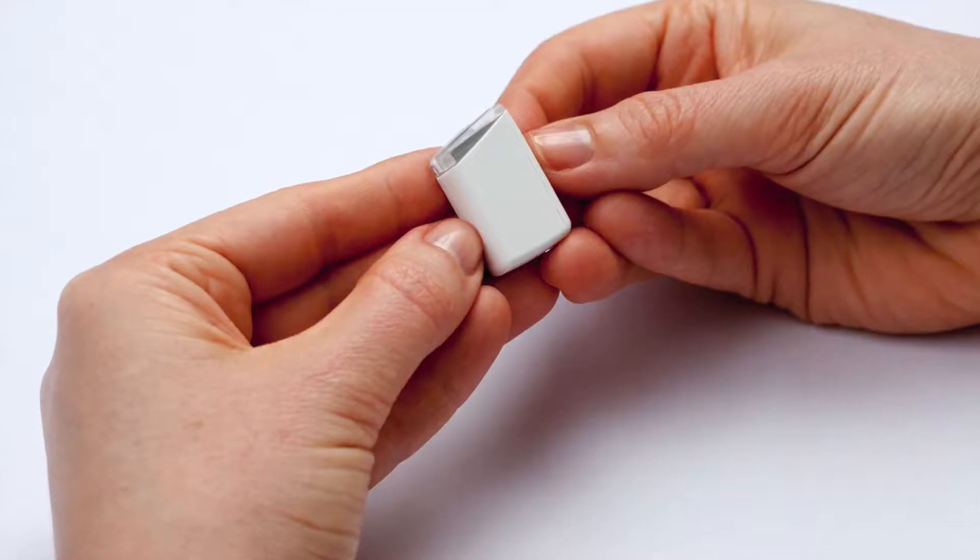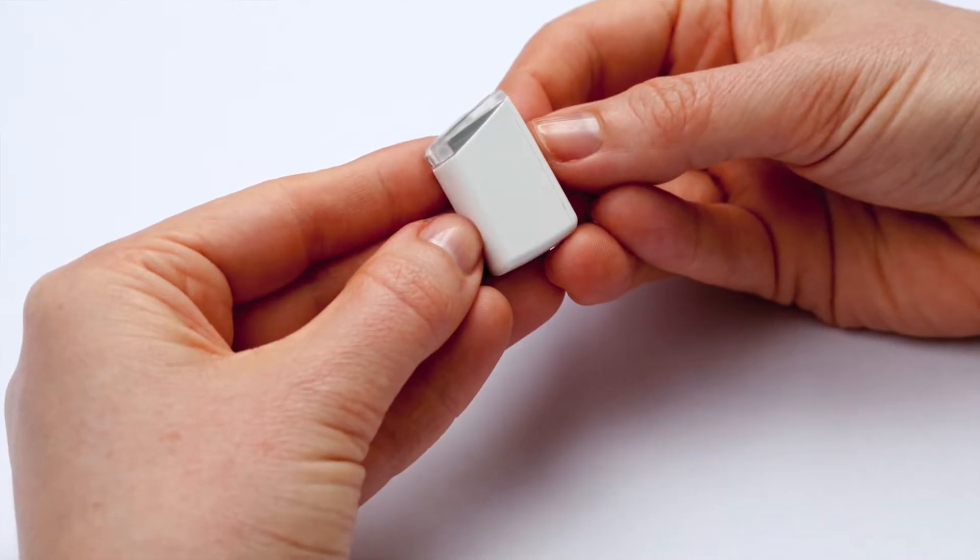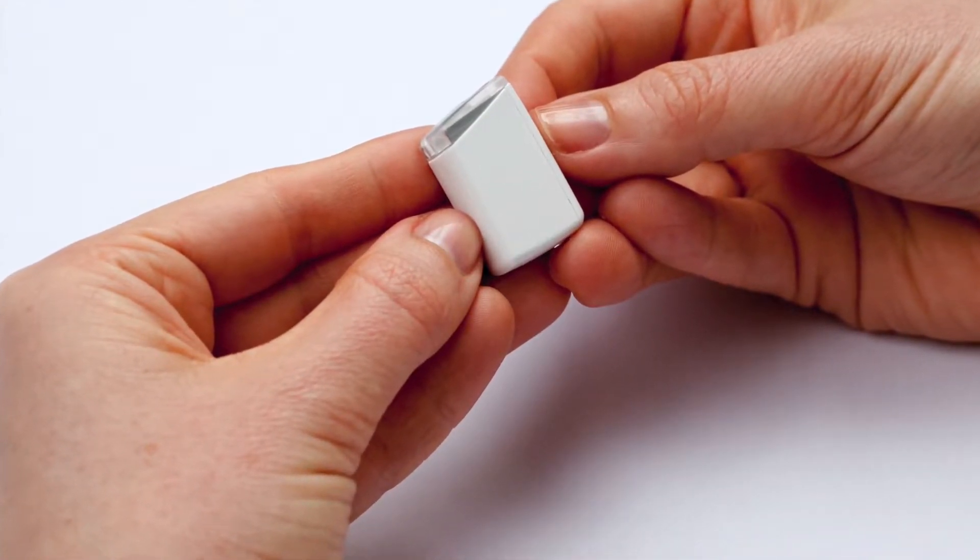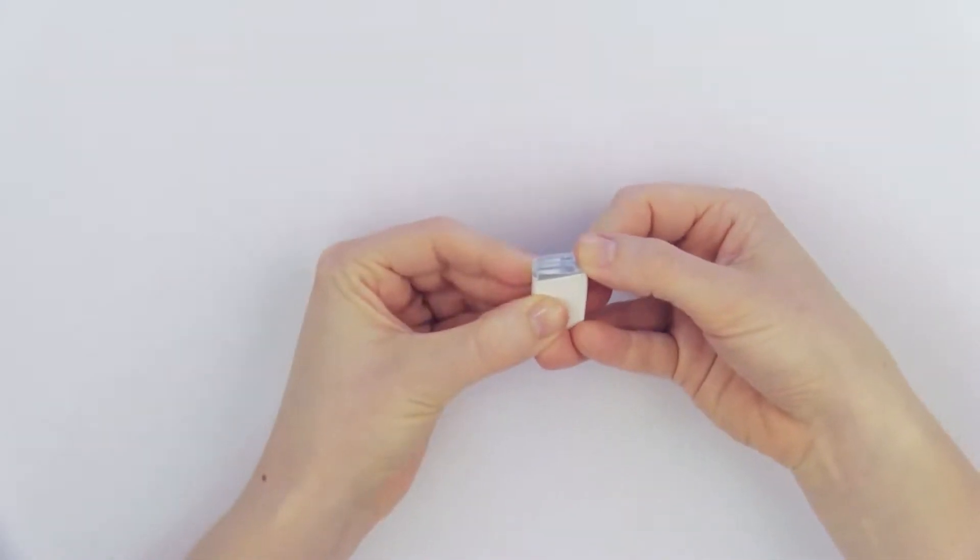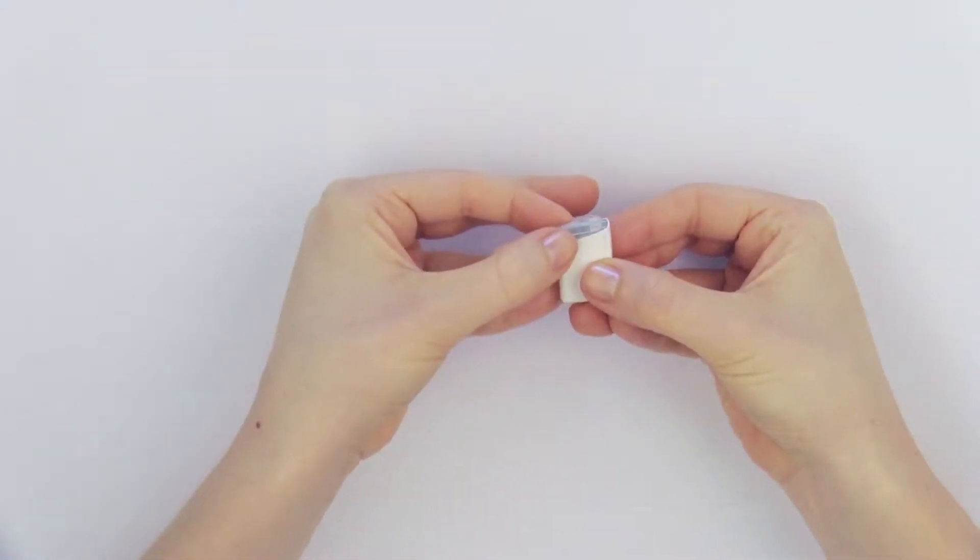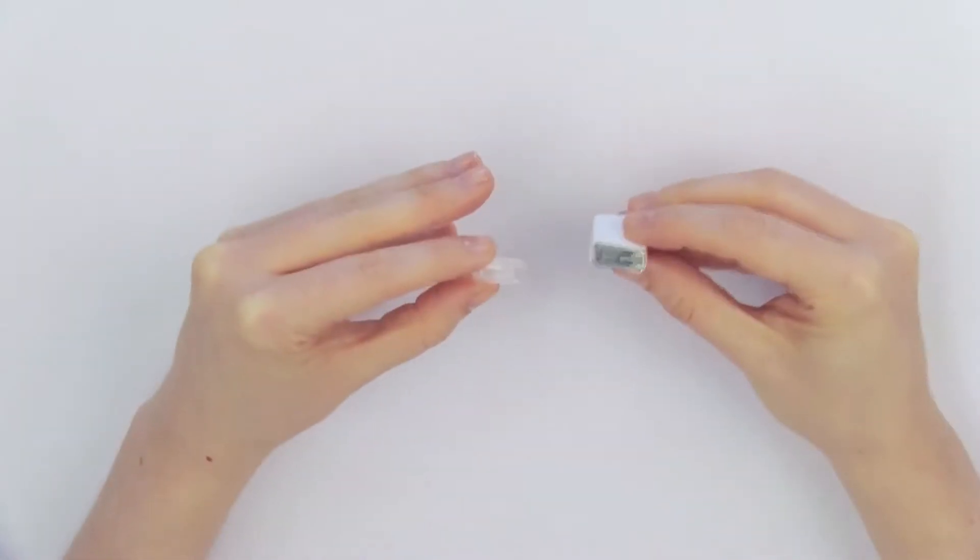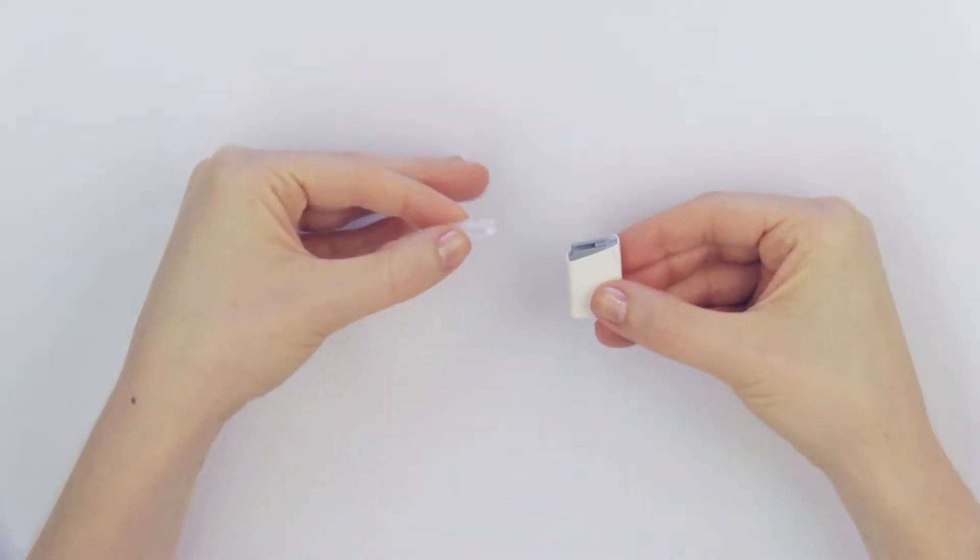To remove the PowerCell cover, hold the PowerCell with the cover attached in one hand. Using the other hand, push the narrow end of the cover with your thumb until it clicks loose. Continue to slide the cover in the same direction until it is fully removed from the PowerCell.